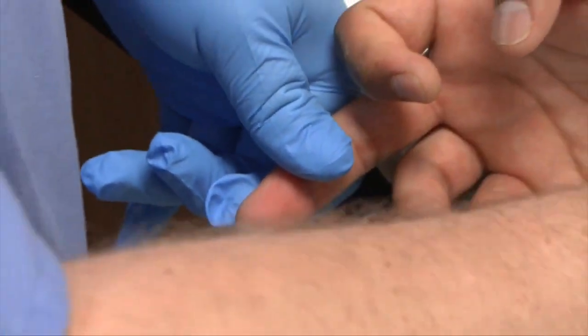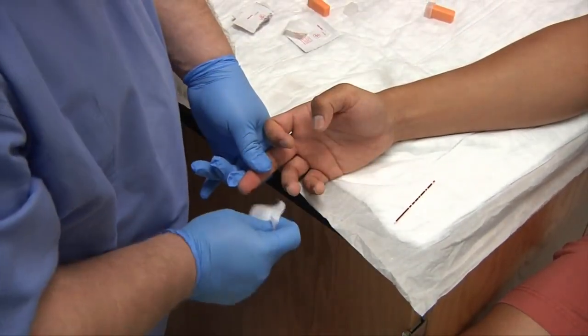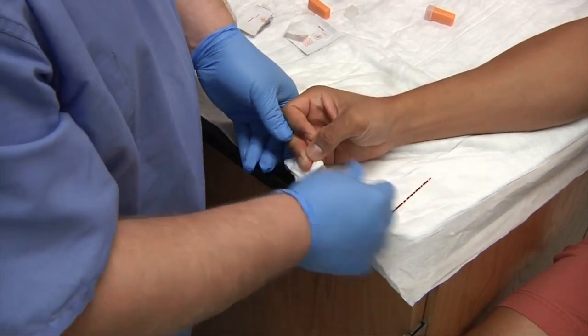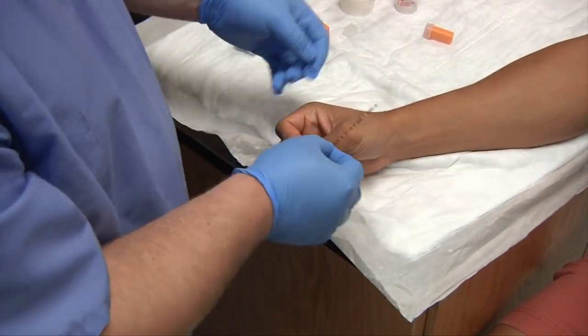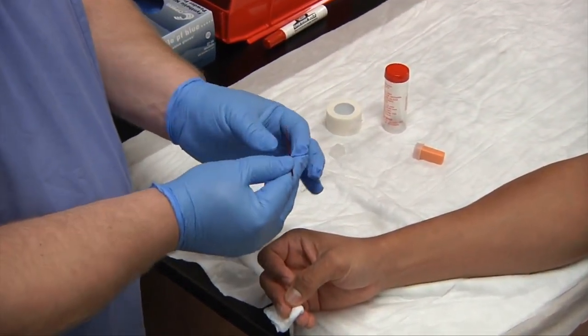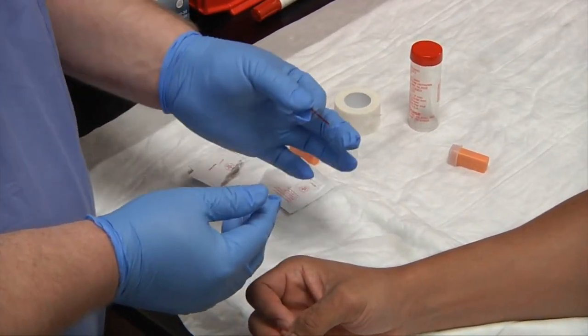My tube is full. Place this down on my disposable chuck, give the patient a piece of gauze, and ask your patient to hold that. And this is how you do a dermal puncture. Depending on your facility, you would immediately process your capillary tubes or take them to your lab.